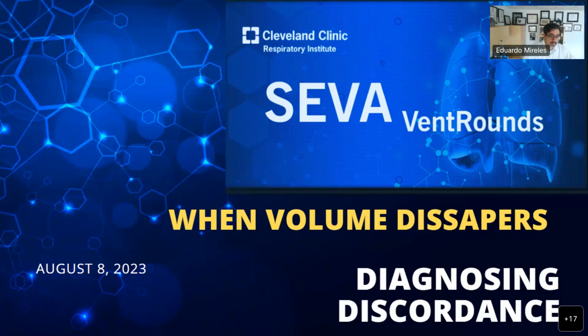What problems were around. And I saw this image that we're going to analyze today, and it has a lot of nice features to go through.